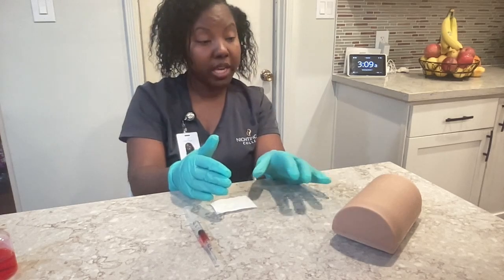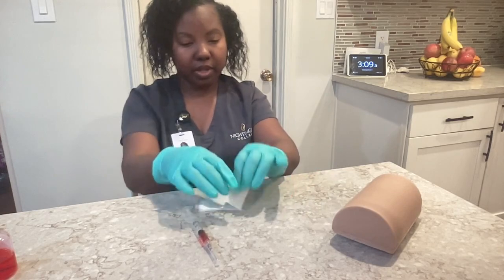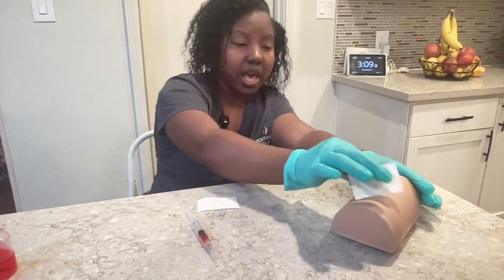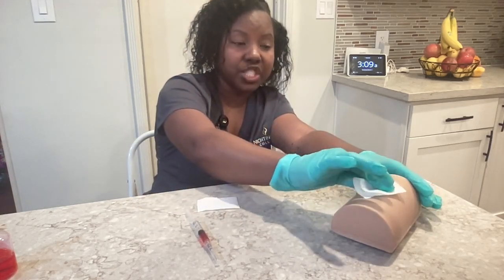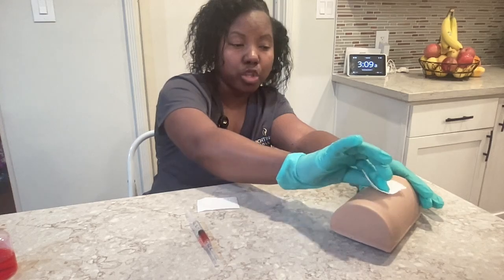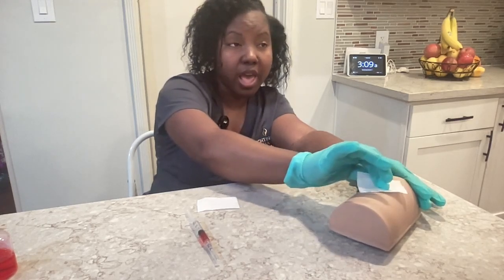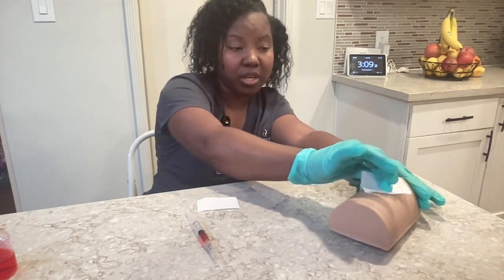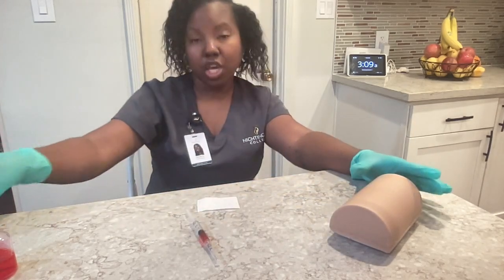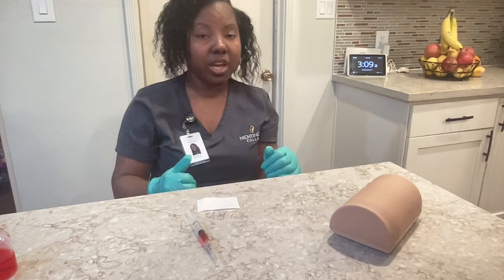This site is okay, so I'm going to go ahead and clean the site now. I'm going to use an alcohol swab and clean the injection site, going in a circular motion starting inward and then working my way outward, over about a two inch space. I will then discard the swab. You want to let it dry on its own — don't fan it to dry it.